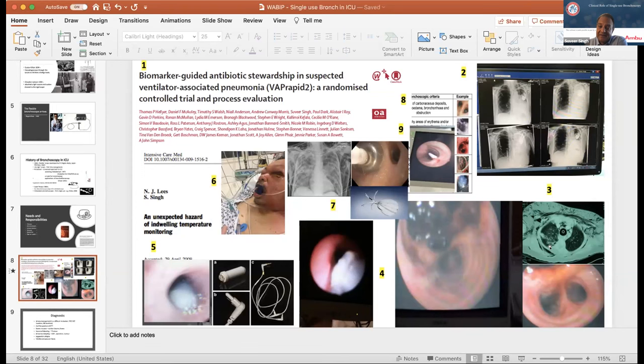And then there are slightly less common adverse events, such as tracheal perforations. But you know, using it as a problem-solving tool can be very important in these settings, or indeed tracheal flaps following tracheostomy, with acute airway obstruction thereafter. Foreign body removal, number five, again, picked up and one is aware of the possibility of that, then the bronchoscopy is an essential tool in that setting.